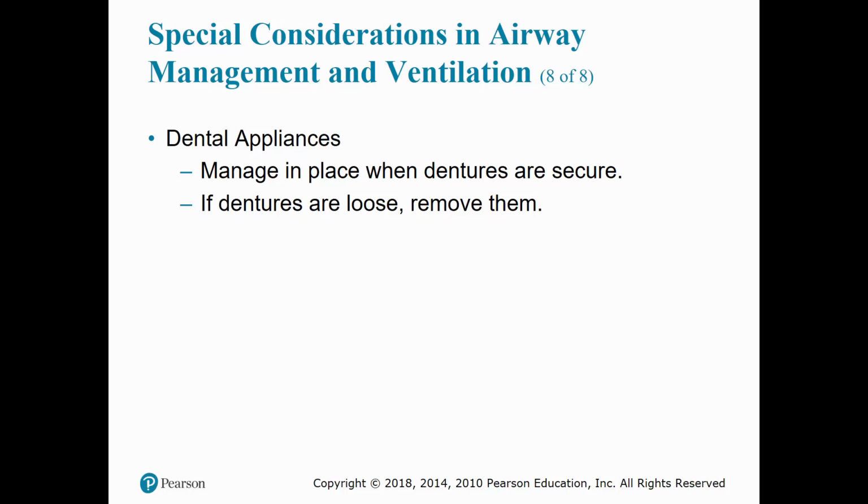It is much easier to establish a tight mask seal with dentures in place. If the dentures are extremely loose, however, remove them so that they do not dislodge and occlude the airway.